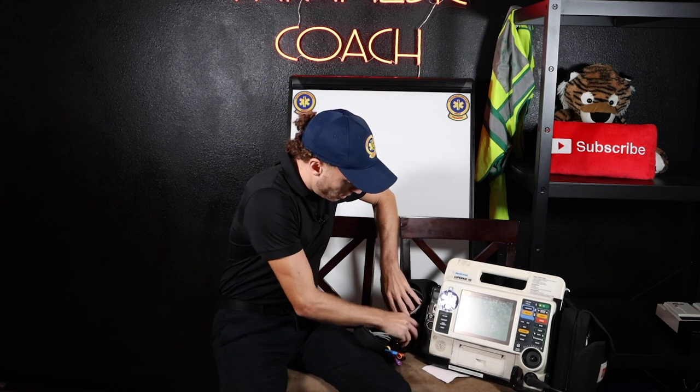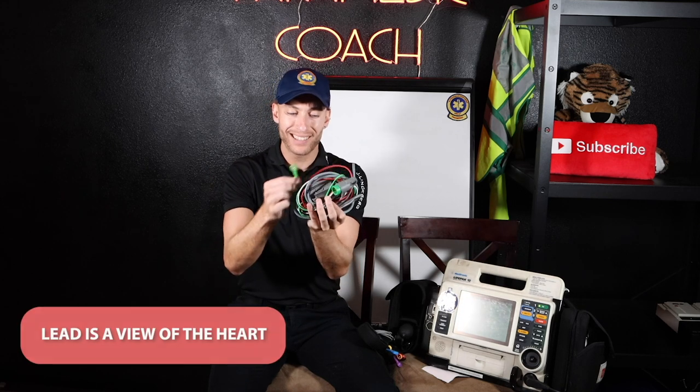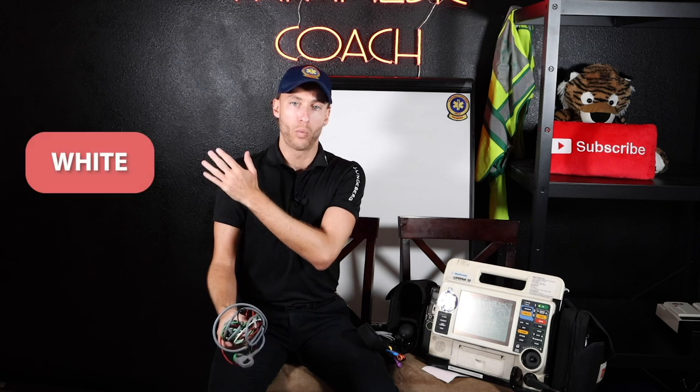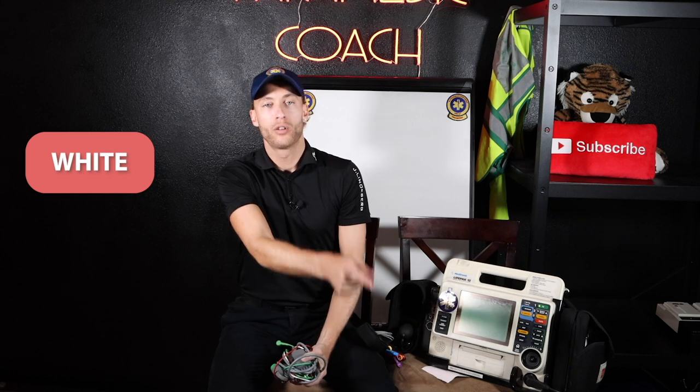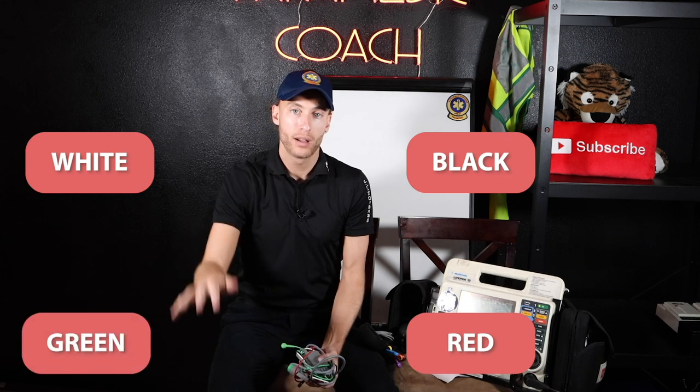These are our EKG wires. What's a mnemonic to remember which lead? A lead is a view of the heart — these are also called leads. Some people call these EKG wires for slang. See all these colors? We got green, red, white, and black. Here's a mnemonic: white goes on the right. We have smoke over fire — so we have black over the red — and then green as the ground, like grass is green. Best place to put the actual stickers is right in here on humans where there's no hair.